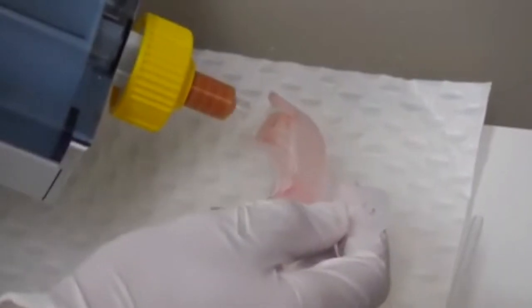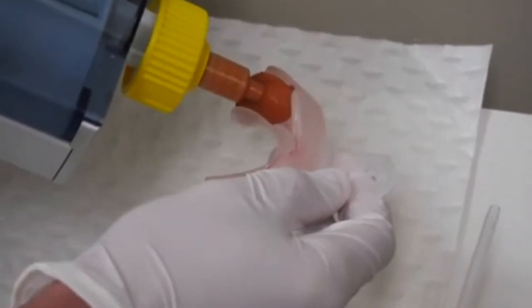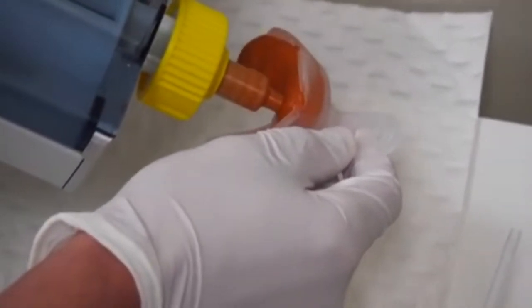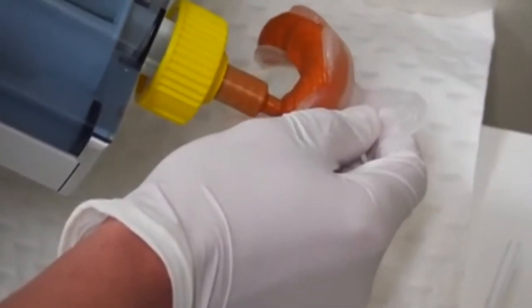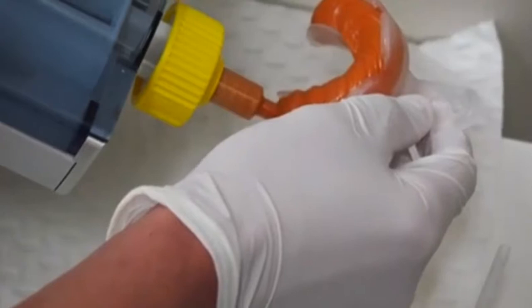The crucial part to getting great impressions is no bubbles, compression, and dry teeth. To get no bubbles, we need to hold the tray at 90 degrees to the nozzle and fill it in one continuous single pour. If you hold the nozzle at 90 degrees, the silicone will build up and then flow out ahead of the nozzle, filling the tray completely to that height.